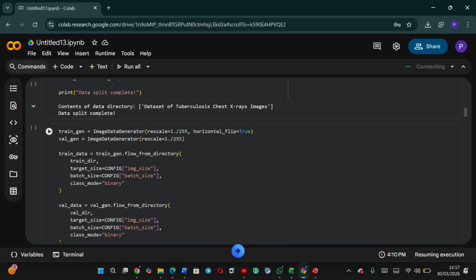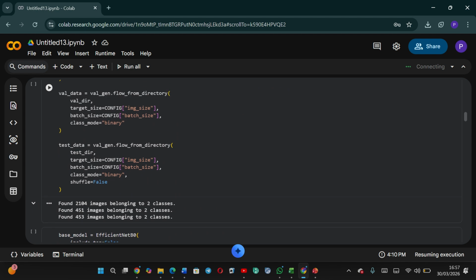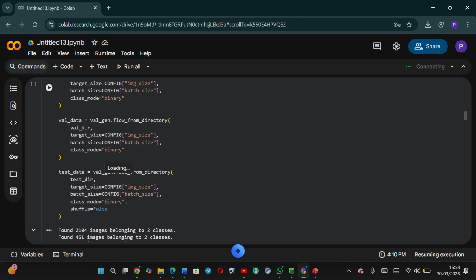Here we are processing our images for the model using the ImageDataGenerator. We rescale the pixel values to between 0 and 1. We apply data augmentations like horizontal flipping for the training. Then we loaded the images into batches. This helps improve performance and prevents overfitting.